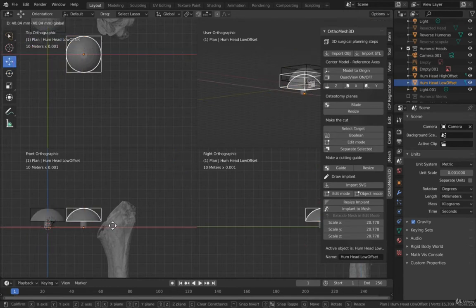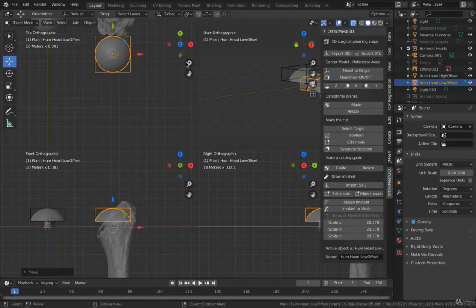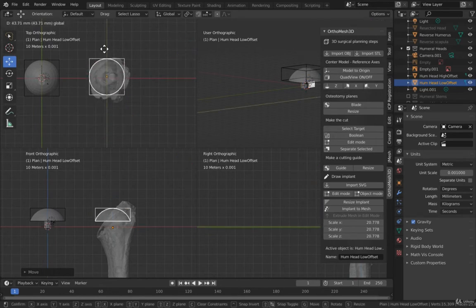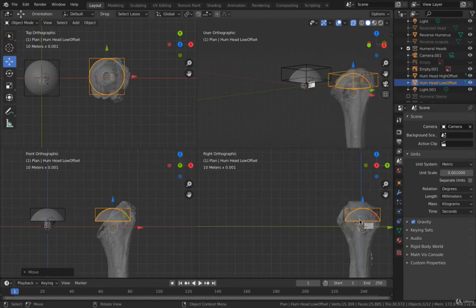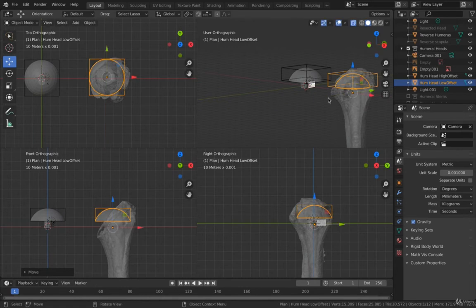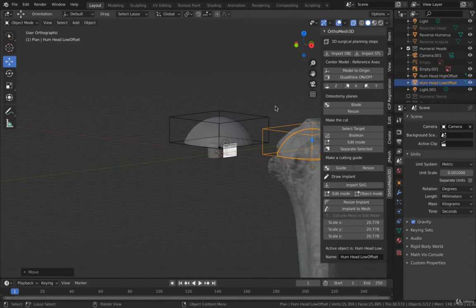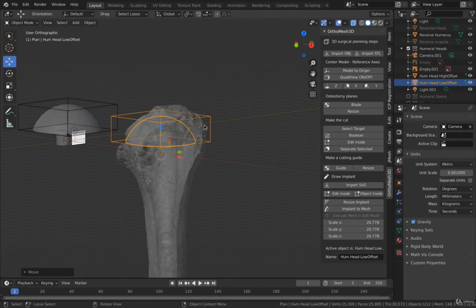I'm going to bring them in closer to the stem, move this so we can see it, and then bring it about to the center of the stem on this view. Press the N key so we can see what we're doing on this side. It looks like we are pretty good in terms of alignment right there. It's just a matter of rotation, and then I'm going to press N again, take the quad view off, and then move everything in the center of the screen so we can see what we're doing.